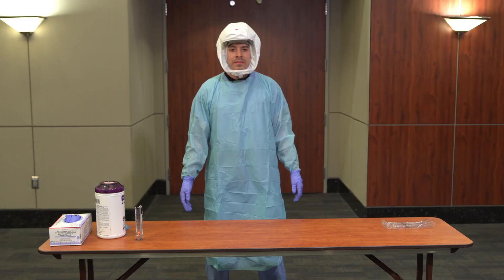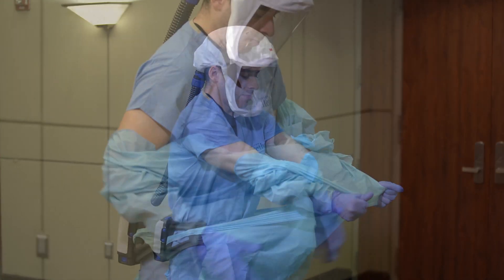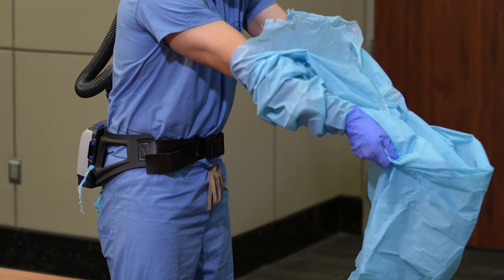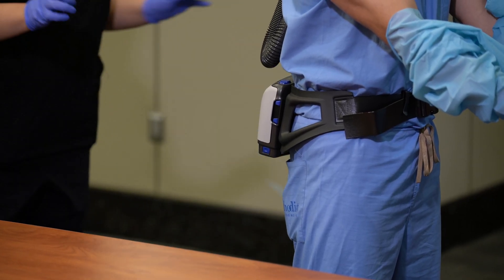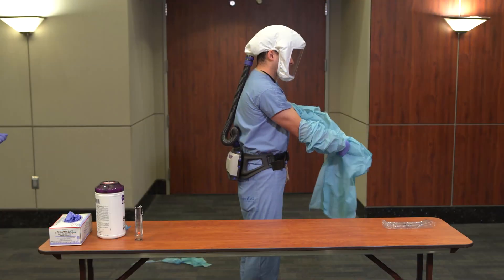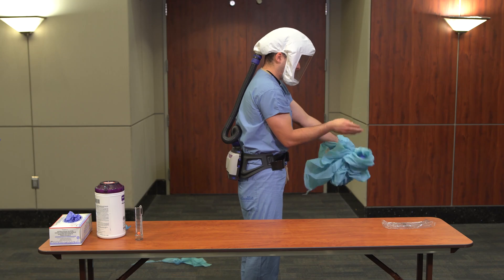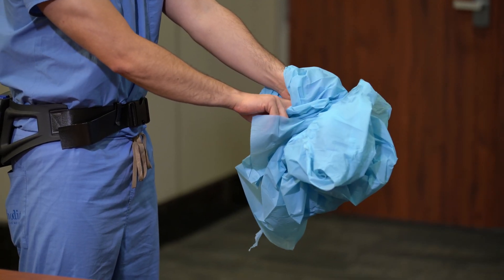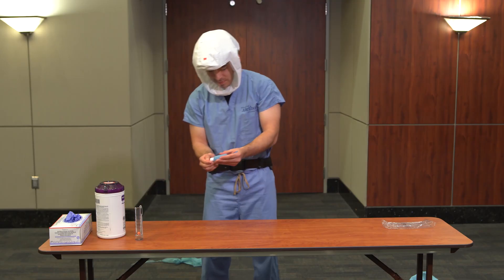Doff the isolation gown and gloves. Grab the isolation gown at the chest and pull forward, then grab at the waist and pull forward. Any remaining pieces should be discarded by a buddy with gloved hands. As you are removing the gown, peel off your gloves at the same time, only touching the inside of the gloves and the inside of the gown with your bare hands. Place the gown and gloves into a waste container. Perform hand hygiene.